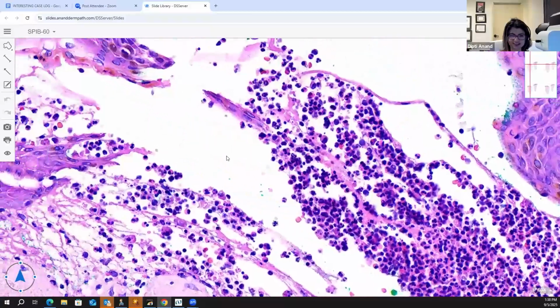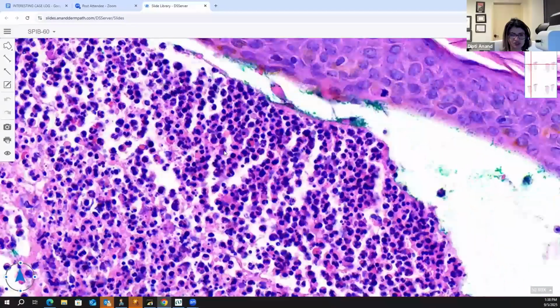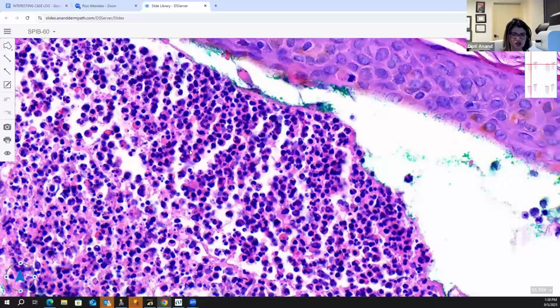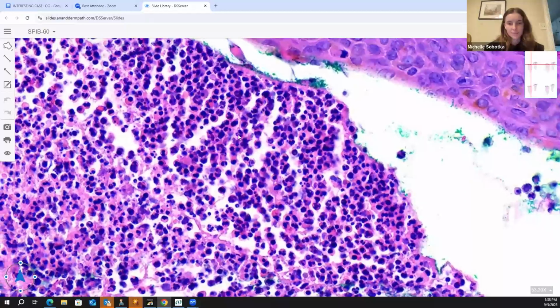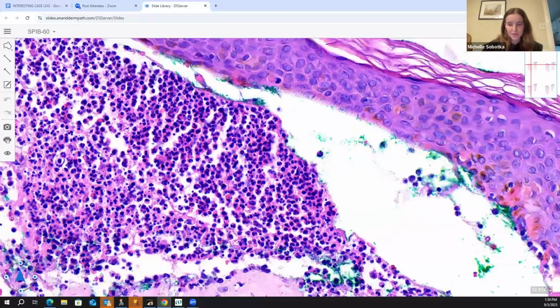So I often make this kind of mistake. It's actually mostly neutrophils. It's not EOs. I'll tell you where exactly is the EO. This is an EO in there. This is a red blood cell. This is a red blood cell. What is looking like an EO is a red blood cell. That's not an EO in there. Other than that, pretty much all the cells are neutrophils. They're not EOs. Okay. So more of the neutrophil.